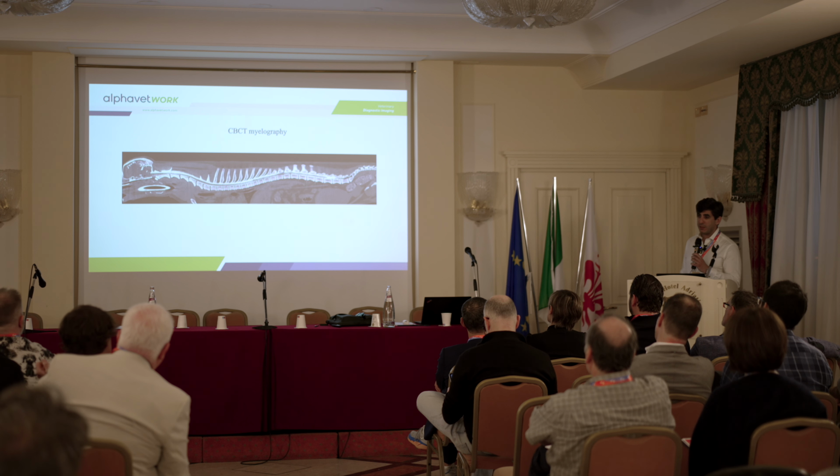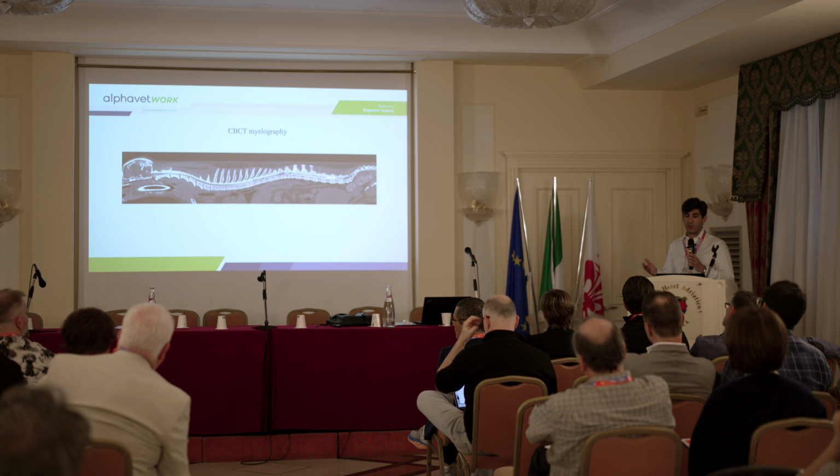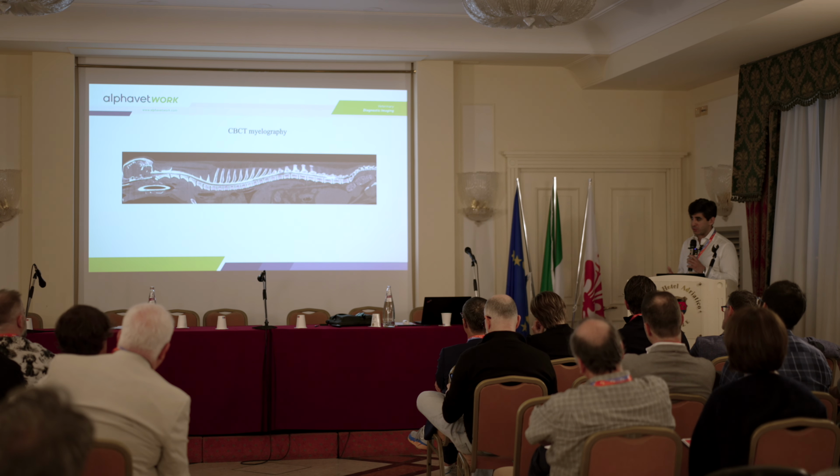And with fluoroscopy, Dr. Kuka will explain, I think he's more experienced in that. With fluoroscopy, you can also do the myelo more effectively, faster, and be more secure if you're not well experienced.